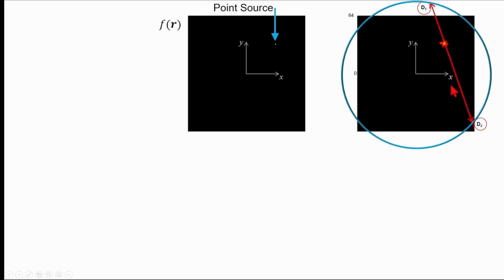And then what we're going to see is how to understand how we can represent that line of response of detection through the field of view. So what I'm going to do first of all is take that XY coordinate system and just rotate it by some azimuthal viewing angle phi. I'm doing that such that this y-axis is now parallel to that line, and then x gives us the perpendicular distance of that line from the center of the field of view of the scanner.